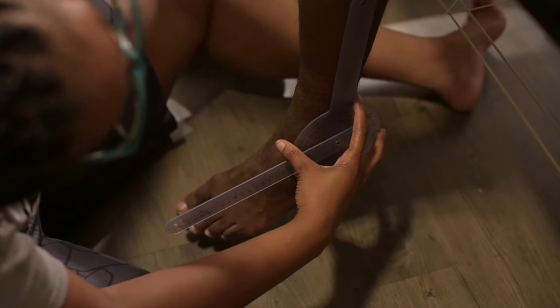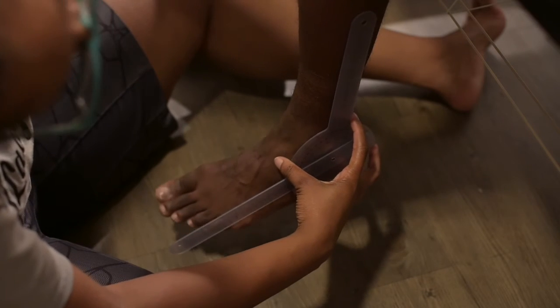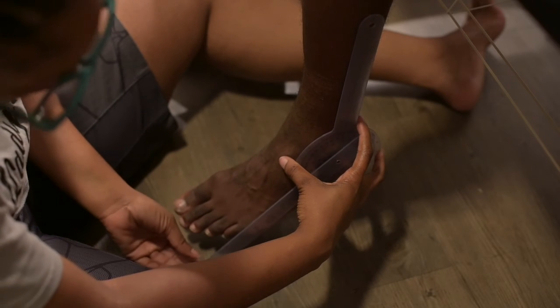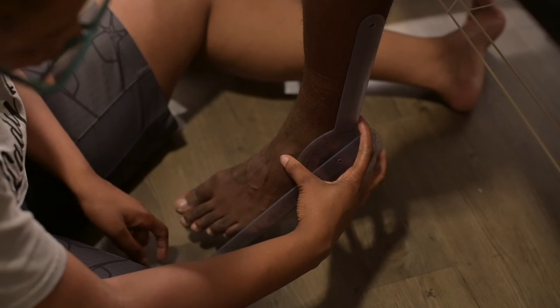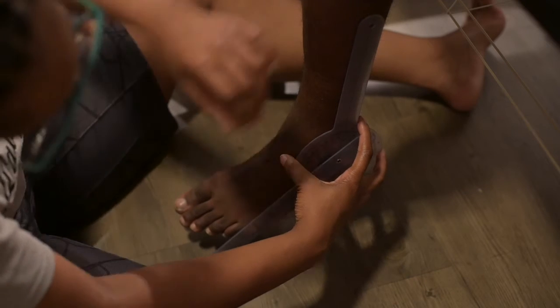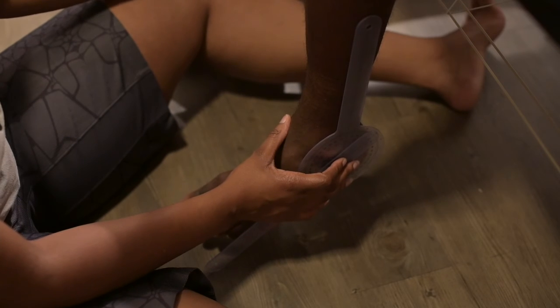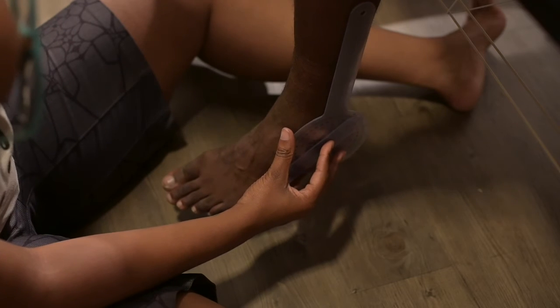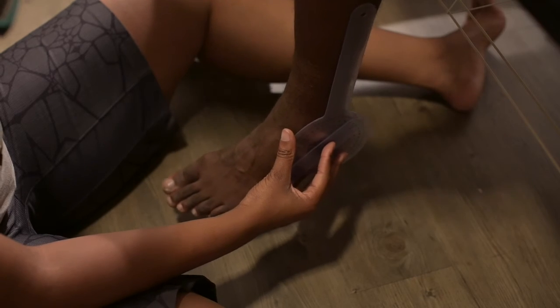Okay. And the axis of rotation will be at the lateral malleolus. And relax your foot. The mobile arm will be aligned at the 5th metatarsal. Okay, so you're gonna go ahead and, can you scoot back? Never mind. No, you're fine. So you're gonna go ahead and flex your foot downward. So this is plantar flexion.